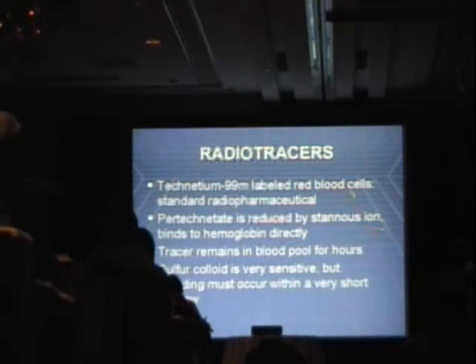We generally use, at the Brigham, tech-labeled red blood cells. This is pretty much standard everywhere. There was an earlier agent, which has some good features, but generally the problem is that it clears very rapidly from the blood pool, so if the bleeding isn't occurring exactly at the time of injection, you may get a negative study.